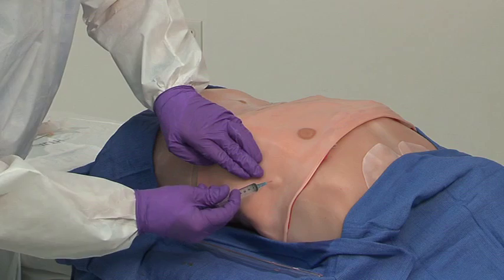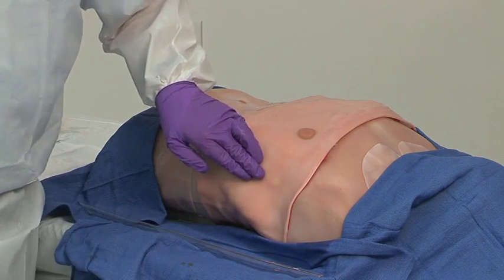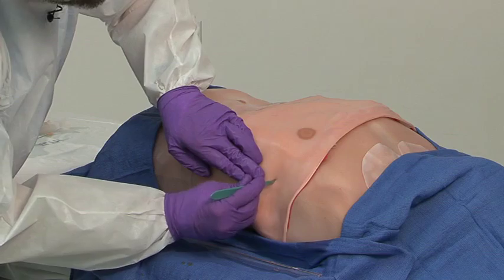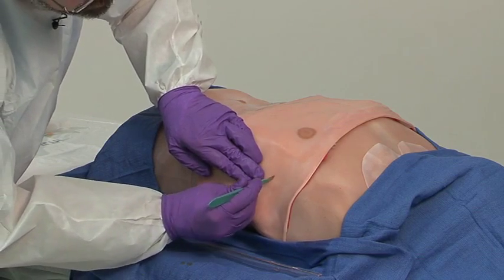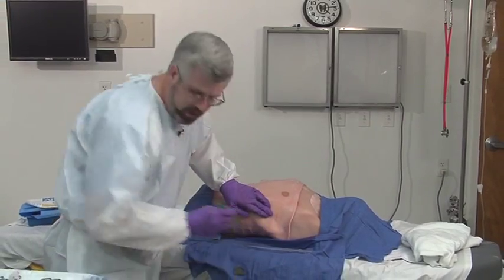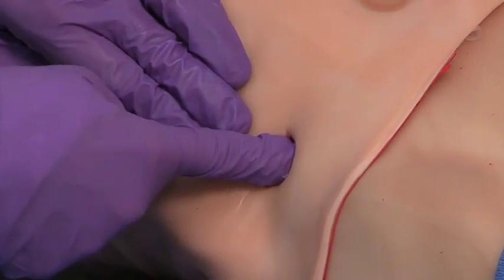I usually like to go down right on top of the rib that I'm going to be making my incision over. I'm then going to take a 10 blade, make an incision approximately 2 to 2.5 centimeters in length over the rib, right down onto that rib. Now, what I like to do is actually verify I'm on top of that rib. I can feel that rib underneath my finger here.